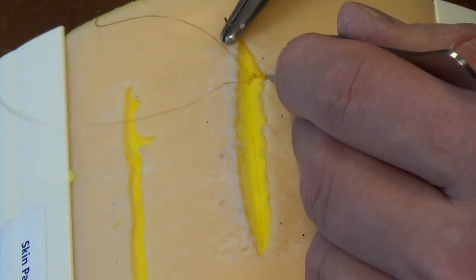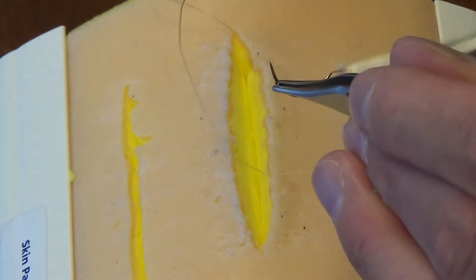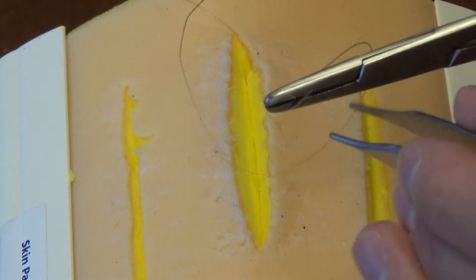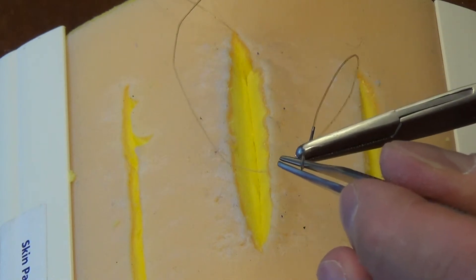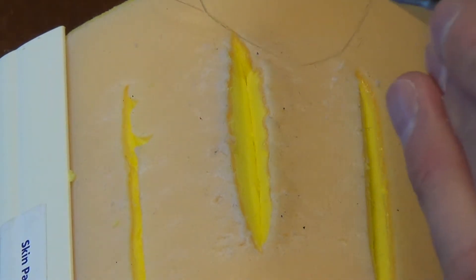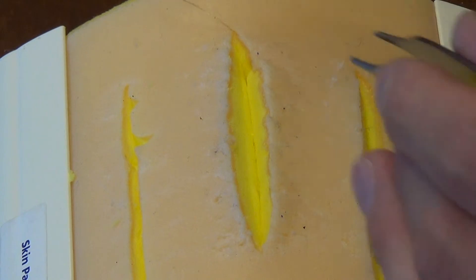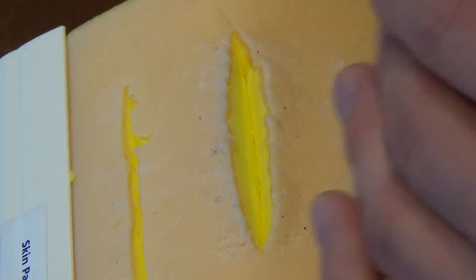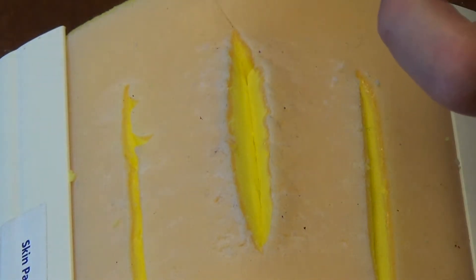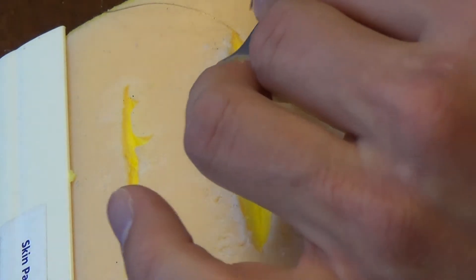So I go back down. Actually, I should never grab the needle at the very point, as I just demonstrated. Now I'm coming out right at the apex. My fixation loop is a bit downstream. I've gone back. Now I'm going to continue down the tissue line.